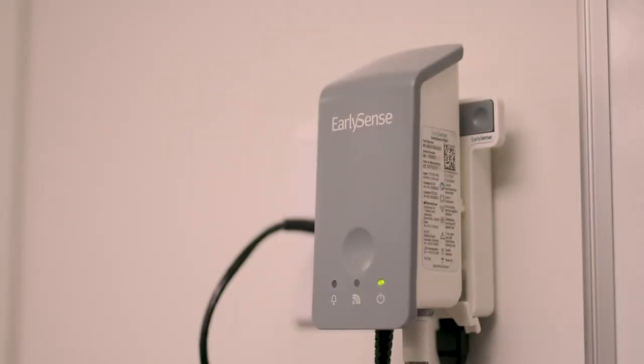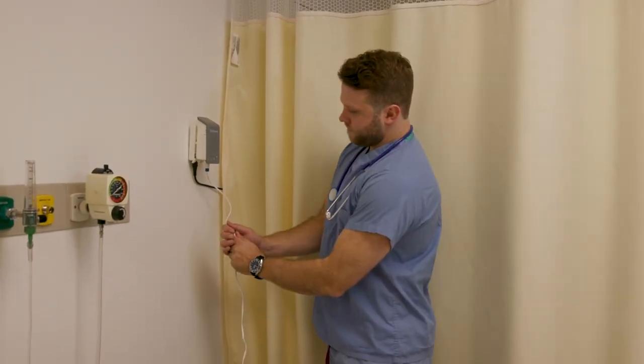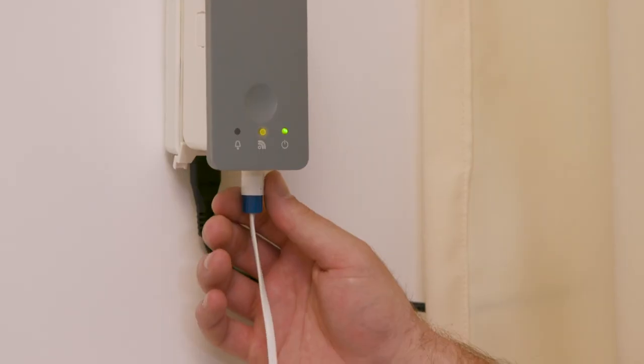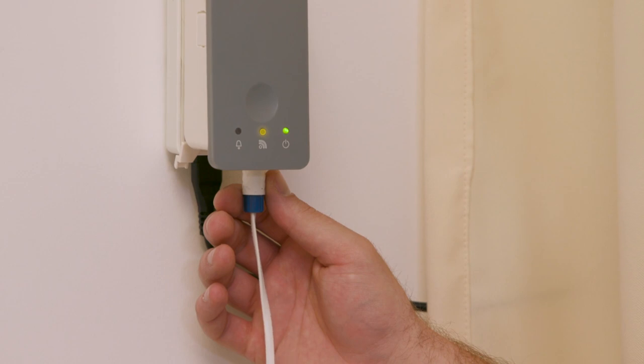A blue alert indicates a technical alert. These alerts cannot be acknowledged or suspended. If you see a blue alert, please ensure the sensor is connected properly by checking both the sensor cable to the quick connect and the quick connect into the InSight device.